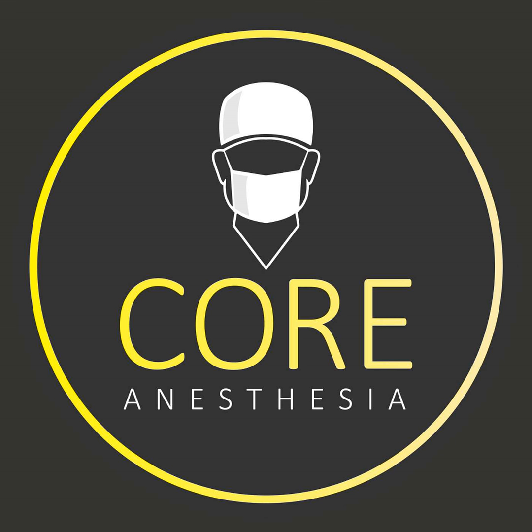This is going to help you obtain a view of the larynx just by indirect visualization. There's going to be a little video camera, like Cole mentioned, at the very tip of the blade. So you're not going to need to directly visualize the cords. You can just look at the screen that will be showing you where the tip of your blade is located. This is going to give you an improved view of the cords because, like I said, the camera is on the very distal part of the blade.